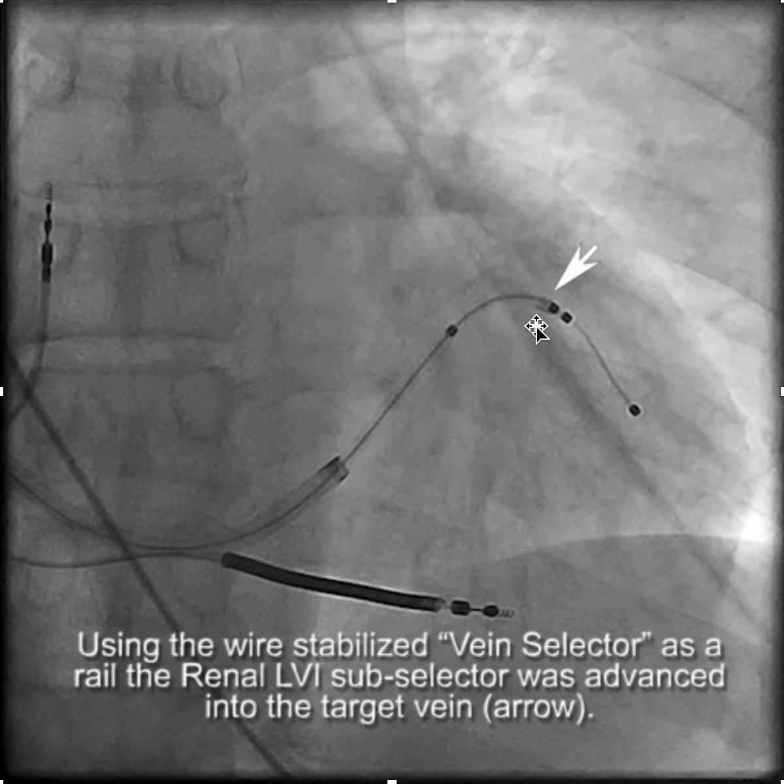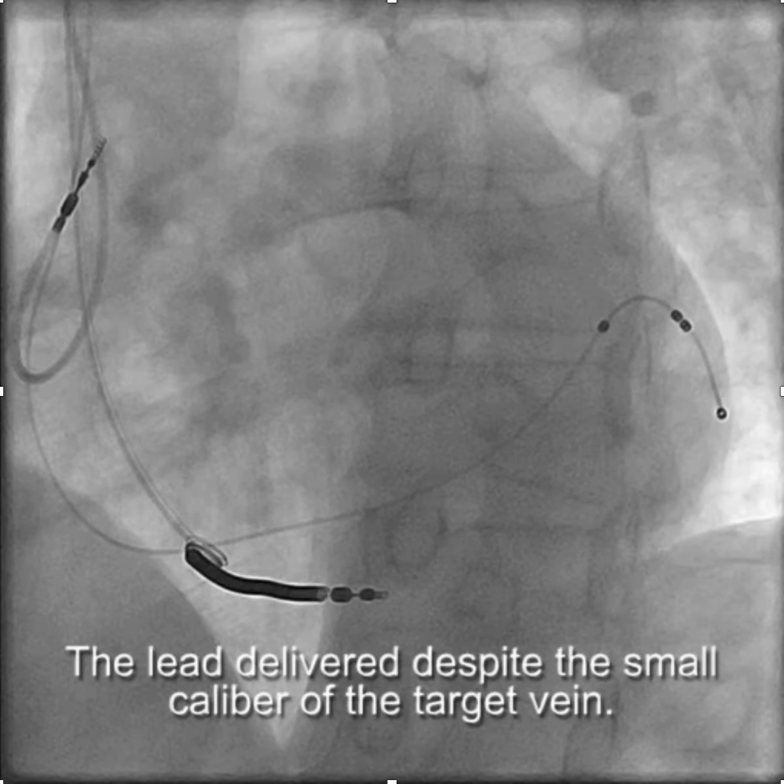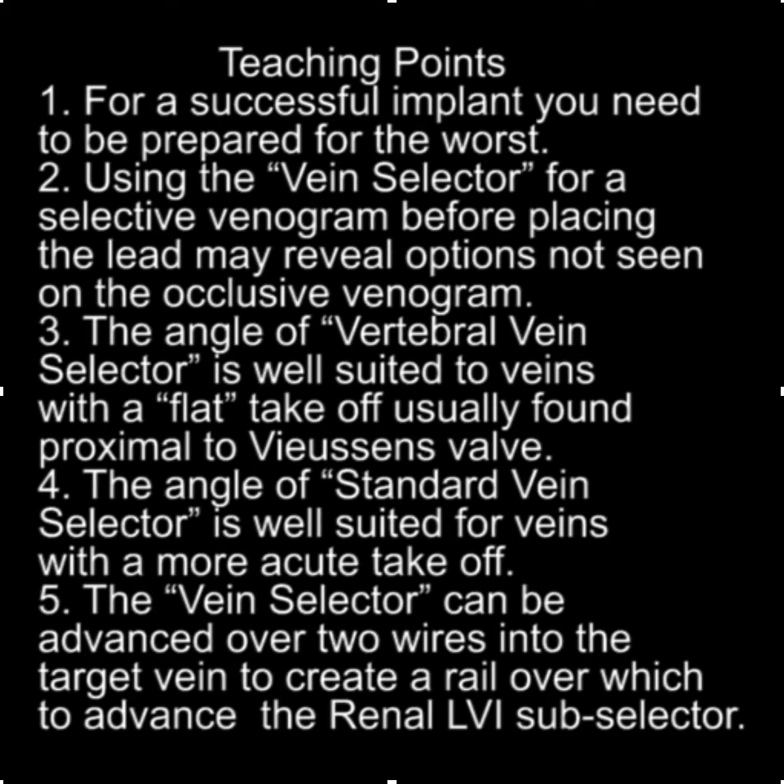From there, we were able to advance the LV lead into the vein and get a good result. The teaching points here are that for a successful implant you really need to be prepared for the worst.